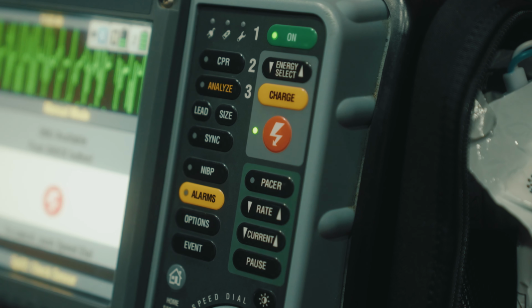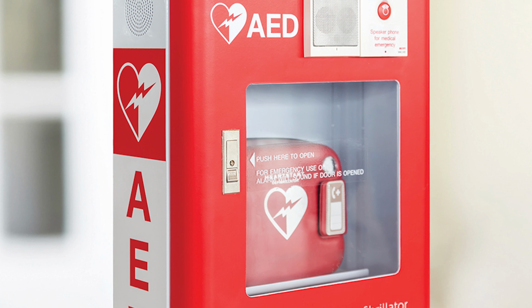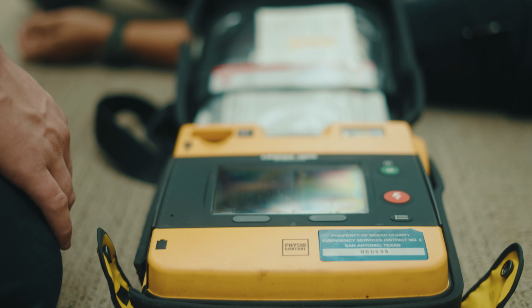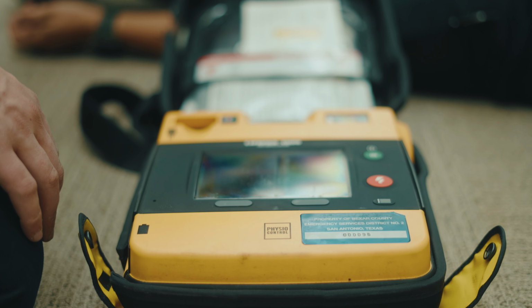There are several different manufacturers and models of AEDs, however, they all operate similarly. Most AEDs, once opened or turned on, will light up and begin with a series of text or voice prompts on how to operate it. It is important to follow those instructions exactly.